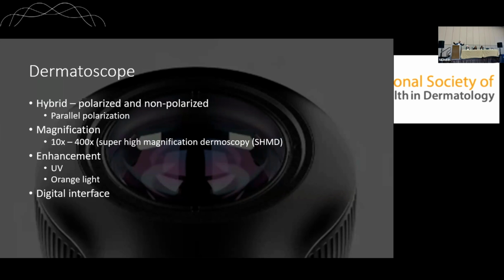Right now it's still handheld hybrids, and then you have digital dermatoscopes, which integrate with larger models where you can store these images. And of course, when it becomes digitalized, you can integrate it with AI, and it becomes an easier way to use AI tools.